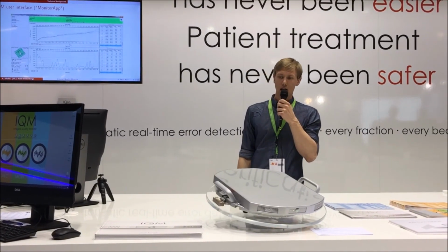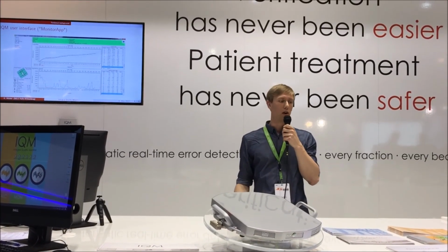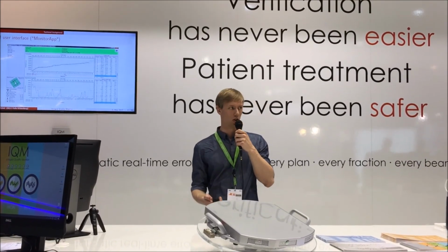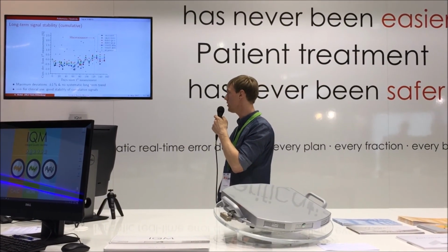But to date, those error tolerances have to be defined within the near future. Before that, we had to evaluate the performance of the detector first, and that's where the measurements I'm going to show you today come into play. The first issue we're going to have a look at is the long-term signal stability.